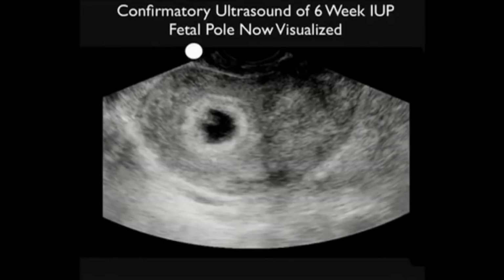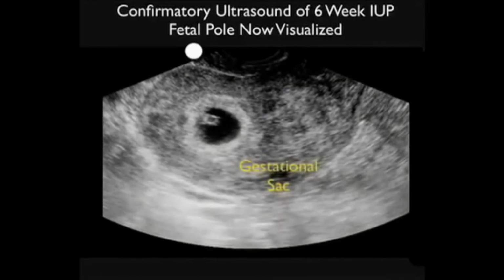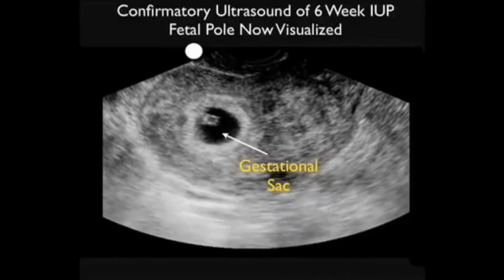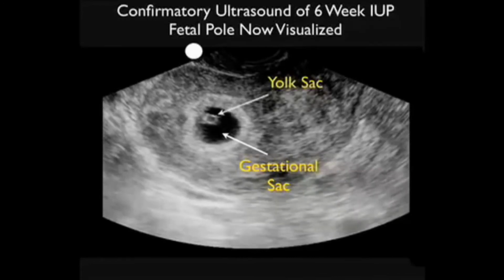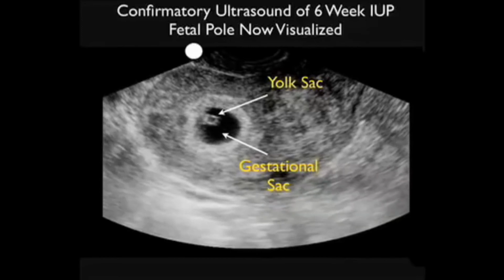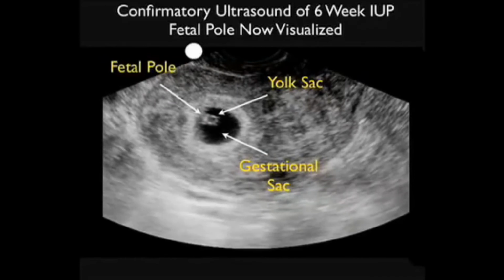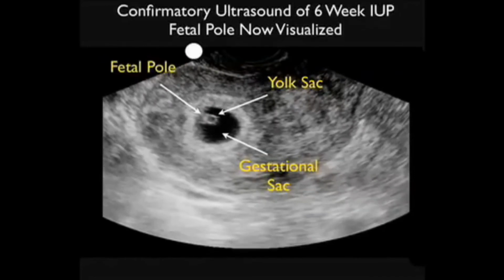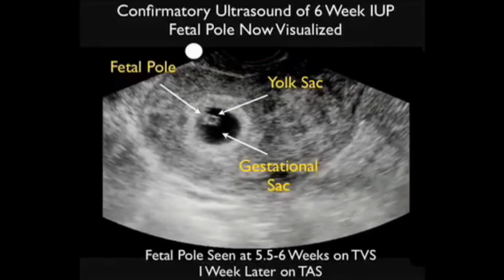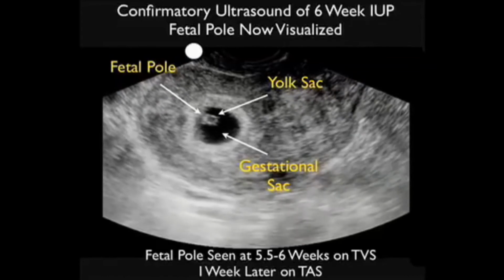Here's a pregnancy that's a little bit more advanced, and here we see a large round gestational sac, that dark or anechoic structure, and inside the gestational sac we can see the circular yolk sac or Cheerio sign. And let's look just to the left of the yolk sac here, and now we appreciate the presence of a tiny fetal pole. Interestingly enough, when we magnify the fetal pole, we can actually see a tiny heartbeat. Now, the fetal pole is generally seen at about 5.5 to 6 weeks on transvaginal sonography and 1 week later on transabdominal sonography.